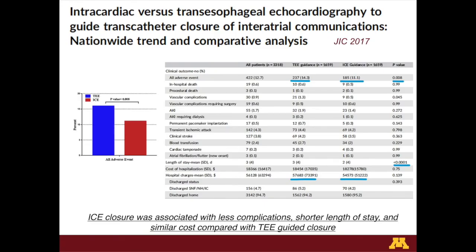And in this really nicely done research looking at national inpatient data comparing propensity matched patients, about 1600 patients between ICE and TEE, it showed that ICE closure was associated with fewer complications, shorter length of stay, and the cost was not a prohibiting factor as well.